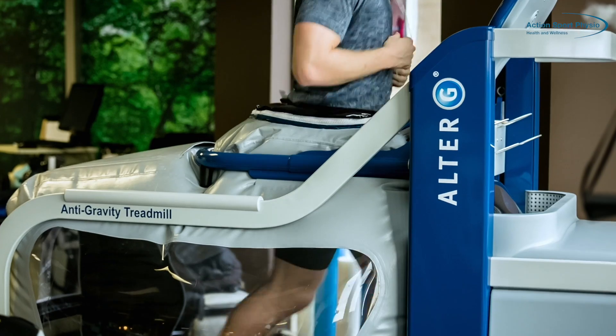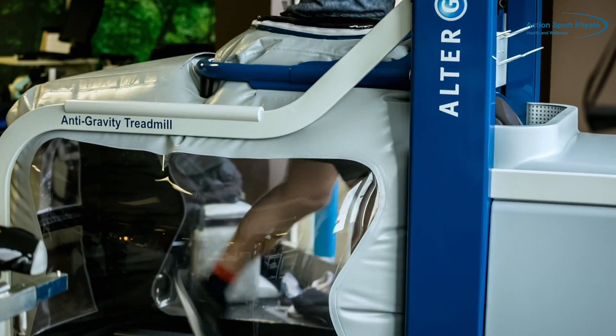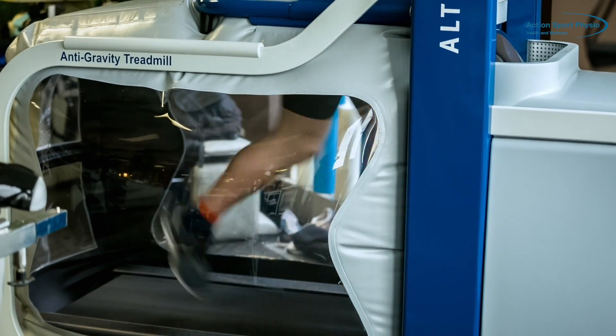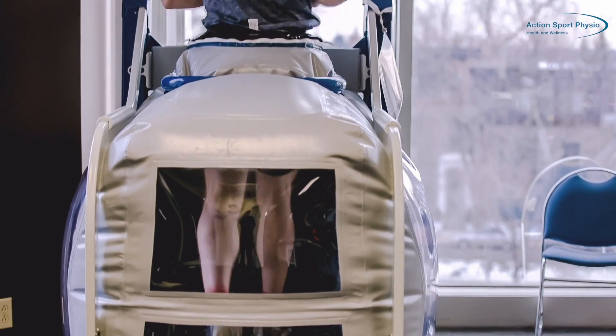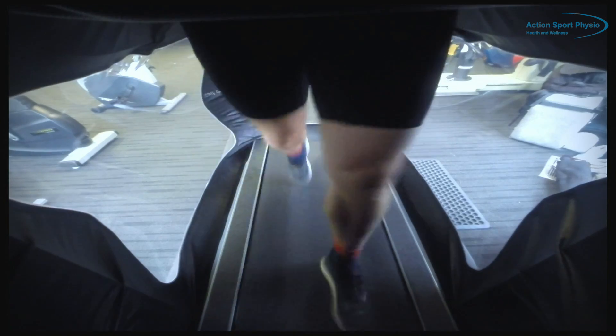So if you're a runner and you're injured and you can't run for more than a few minutes, or you can't run at all because of your injury, the Alter-G allows you to run for much longer by reducing your body weight, which will reduce the mechanical stress on your injured structure and allows you to keep training despite your injury.